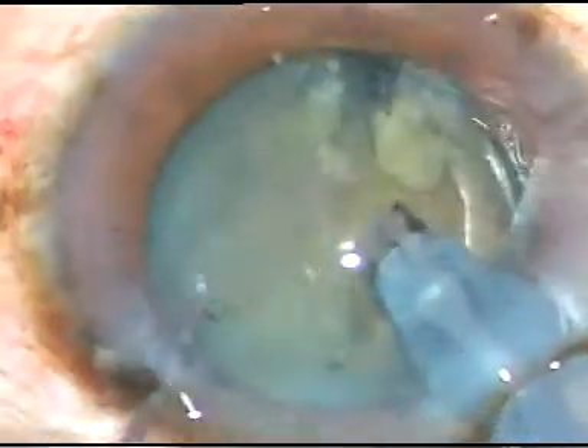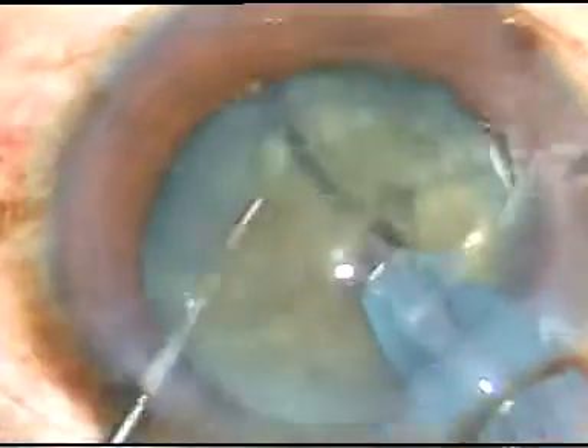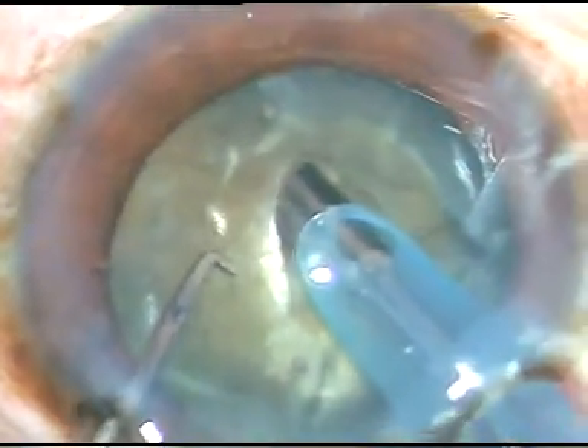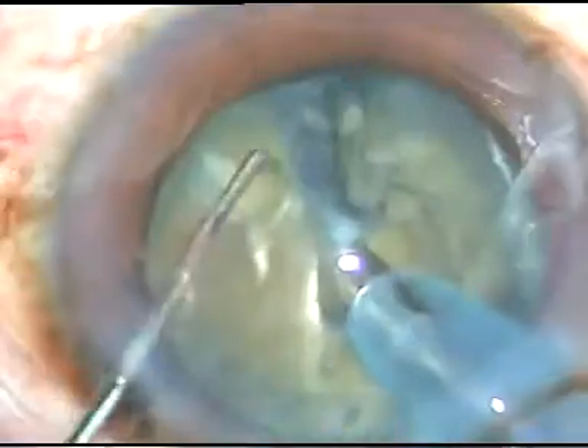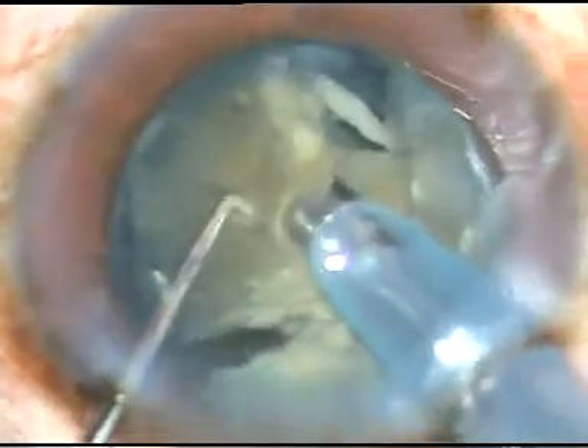I rotate the nucleus, hold it with high vacuum, and chop it. Rotate it again, and I am placing the bevel of the tip of the phaco-handpiece to the left side so that it occludes nicely. I get a firm grip and I can chop the nucleus. The nucleus is divided into several parts, and each part is now emulsified and engulfed.